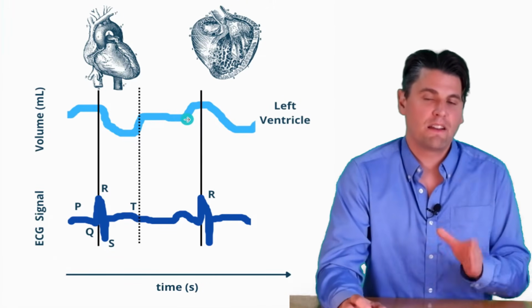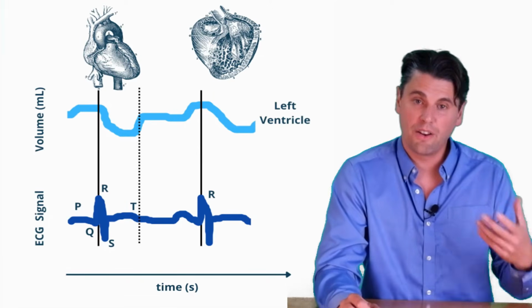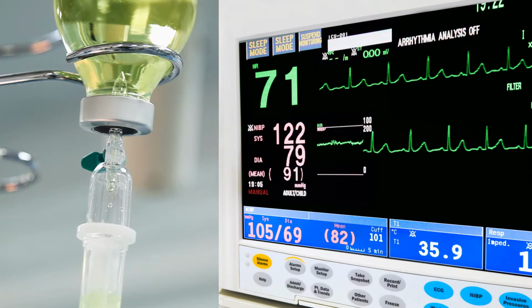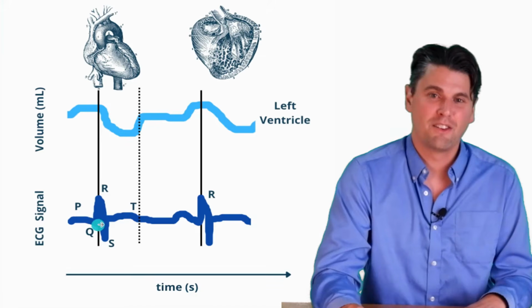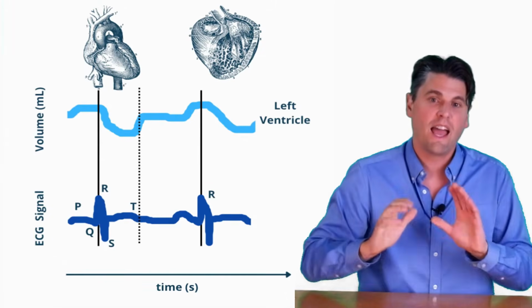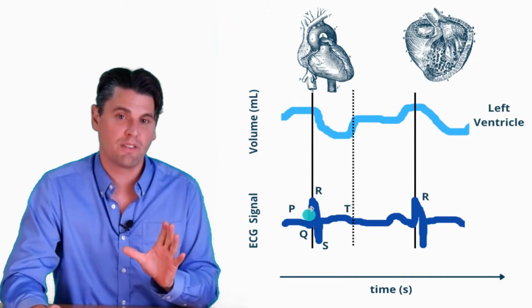And how can we identify the area where there's less motion? We're actually going to use another signal, and it's actually the electrical signal. So there's an electrical signal, and you're probably familiar with ECG or EKG if you're in Germany. In the heart, there's actually an electrical signal that's generated in order to tell the heart to do the contraction. And this is what's called the QRS complex here. It's the biggest measurable peak in the electrical signal.